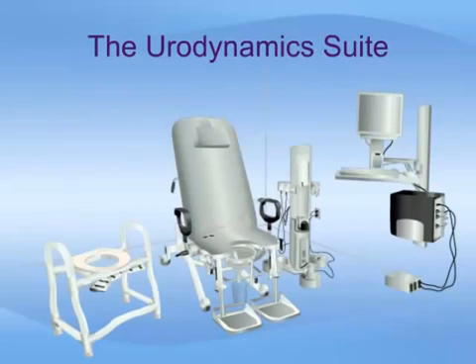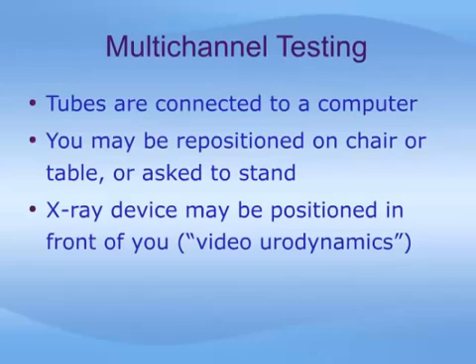This photograph shows a typical urodynamics suite. There are many different setups available. Once the catheters are positioned, they are connected to a computer which records the pressures in your bladder and plots out a graph. You may then be repositioned on the chair or table, or you may be asked to stand. If you are having a video urodynamics study, an X-ray machine will be positioned in front of your bladder.